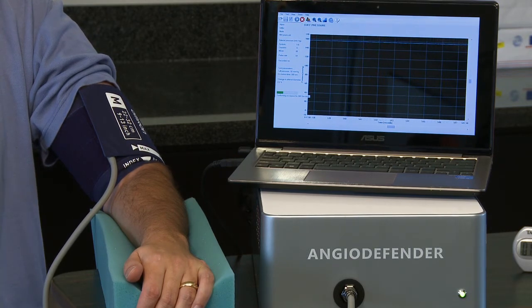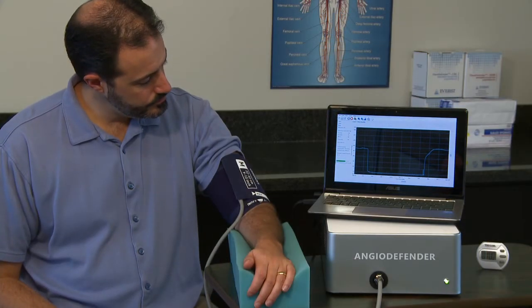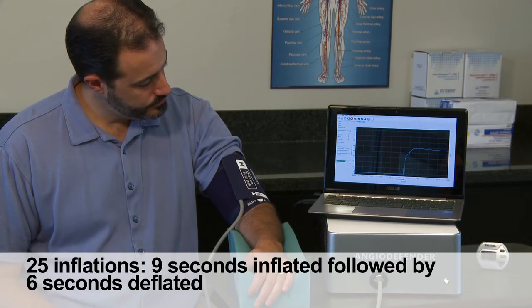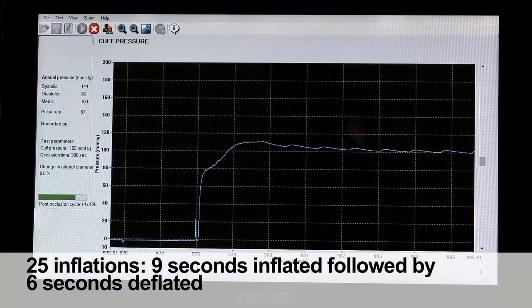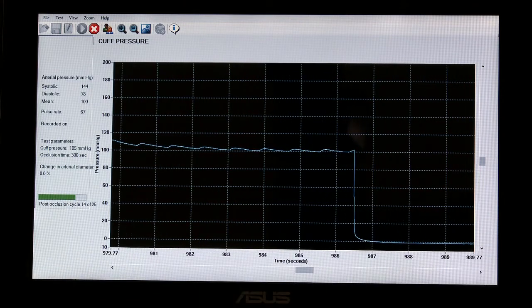Approximately 30 seconds after the cuff deflates, the system begins a sequence of 25 non-occlusive pulse wave measurement cycles, using the same pressure and sequencing as used prior to the five-minute occlusion.